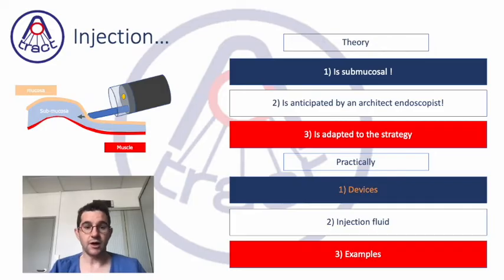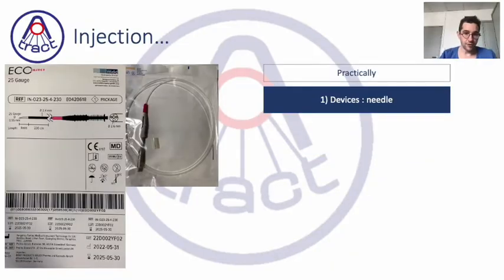Practically now, what is needed to perform your injection properly? First, you need a needle, and it is difficult to find a very good needle to do your procedure.